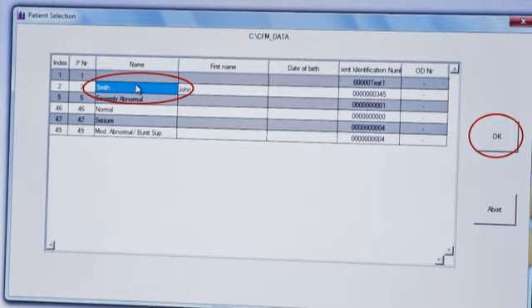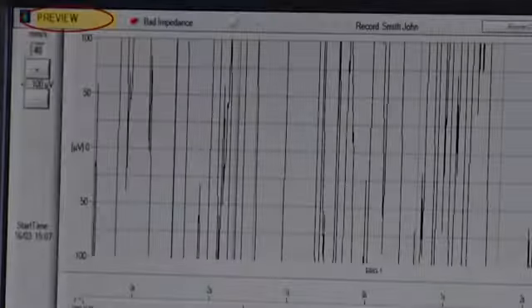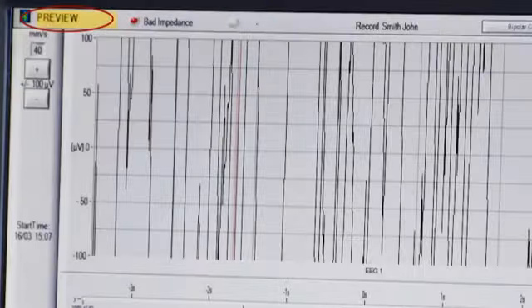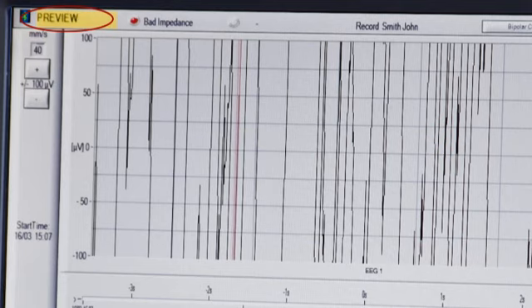Select the patient from the drop-down list and click OK. Initially, you will enter a preview mode. Here you can adjust the layout and carry out an impedance check to ensure your electrodes have good contact with the patient.